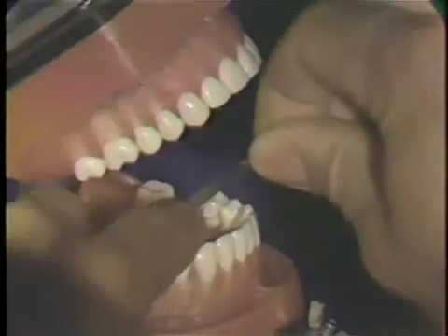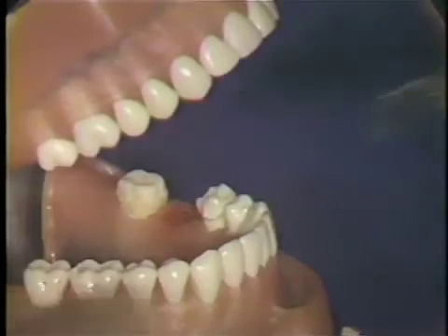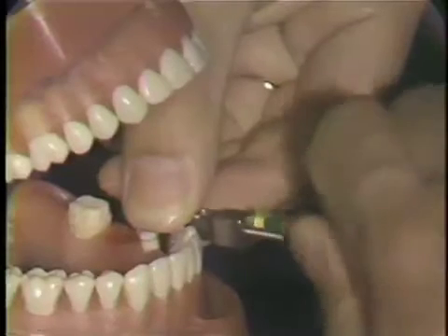A lightening strip is used to open the contact on the mesial of the bicuspid in order to allow sufficient space for a matrix band. The matrix band is placed on the first bicuspid to act as a guide in the protection of the distal surface during the preparation phase.